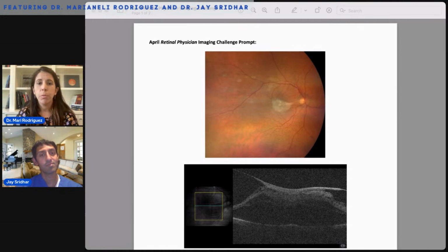So when I talk to them about surgery, I do very much like a functional approach and not so much by how the OCT looks. Because I agree, sometimes you look at an OCT and you're like, oh my gosh, I'm sure that's like a 20/100, and they're like 20/25, they're not bothered. And then sometimes a membrane that doesn't look too bad, the patient is really bothered. So I try to do more of a functional assessment when I discuss with them before agreeing to the OR.